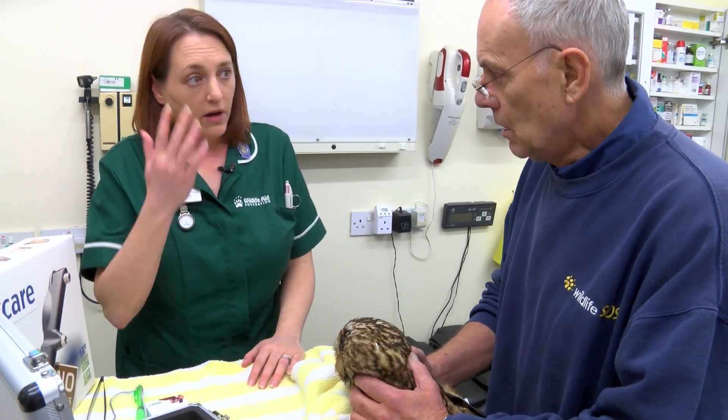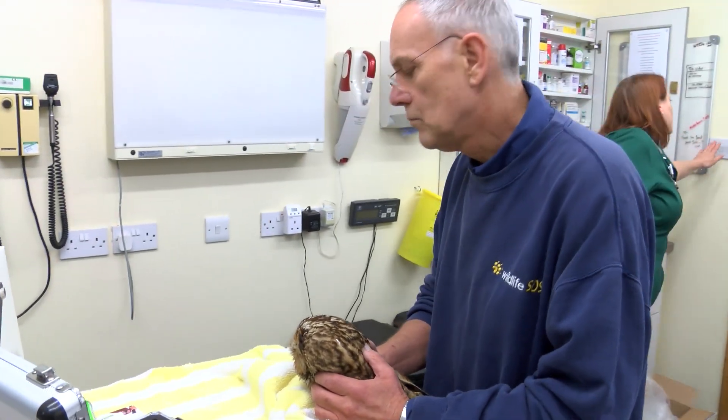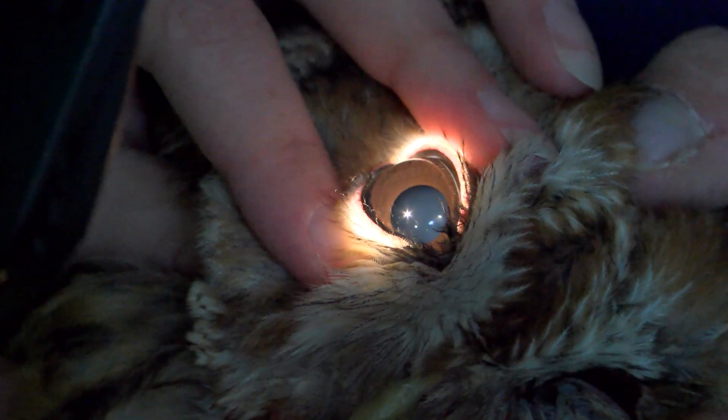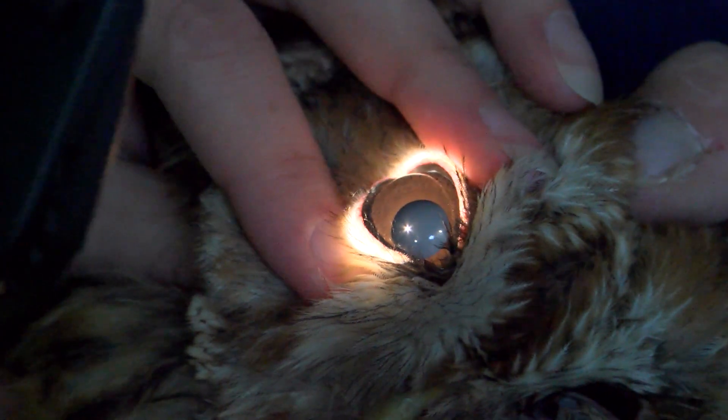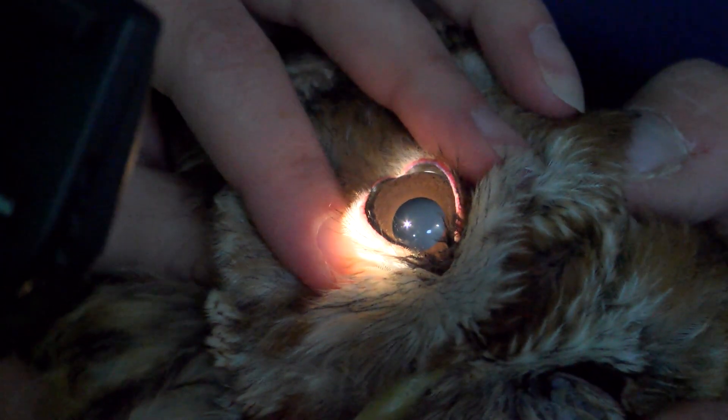So we're just going to have a quick look in the eye and see what's happening with the hemorrhage. I'll just turn the lights off. It's a good start if you look at the normal eye first — you'll see that I can see his iris and his pupil.